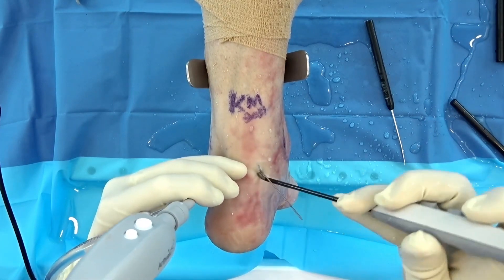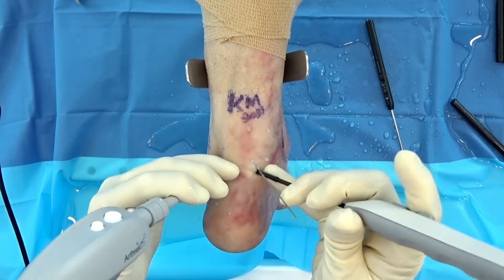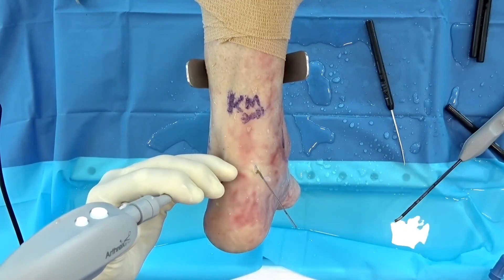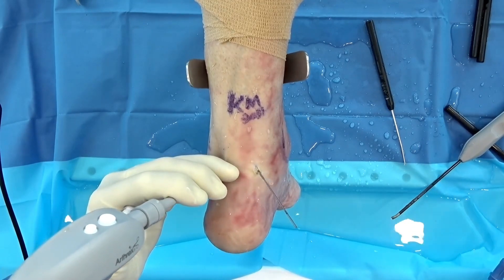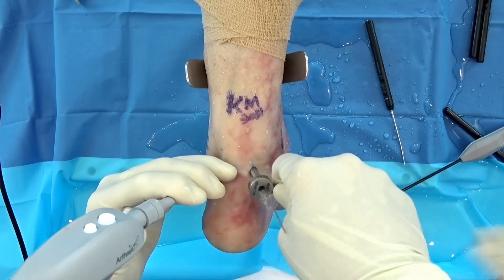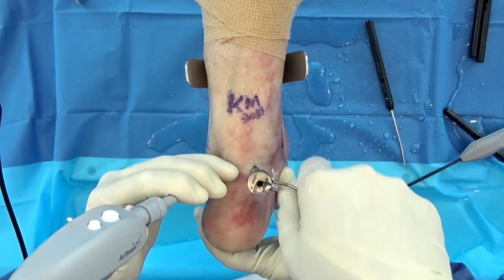At Ohio State, the trauma team doesn't love foot and ankle trauma, so we get it on our end. For the posterior malleolus, same approach. We came out with a paper on this earlier this year, so we can verify it with good evidence. We get around it, and now we have our drill — measure, and then countersink per the normal steps for any screw. Just because you're doing it with a scope doesn't mean you change your principles. All the same principles apply.